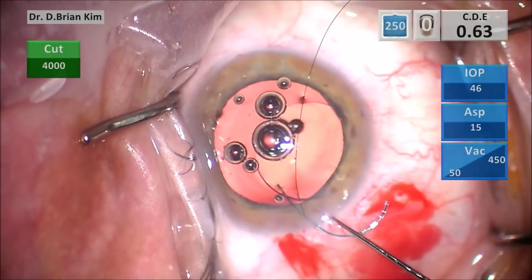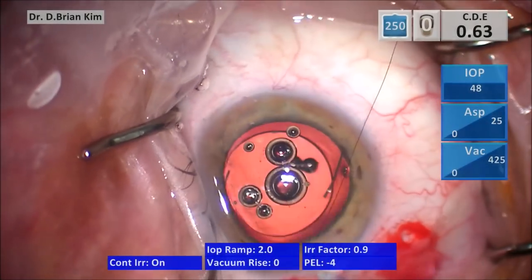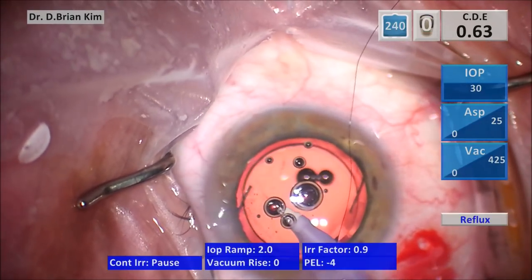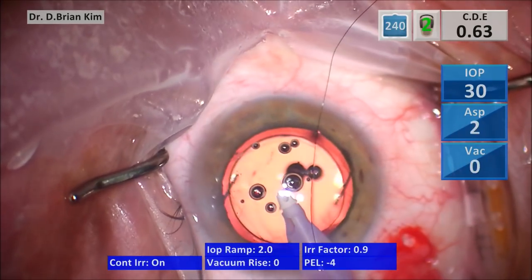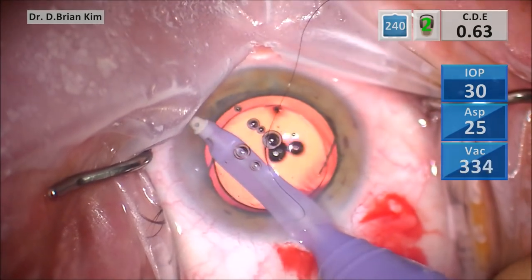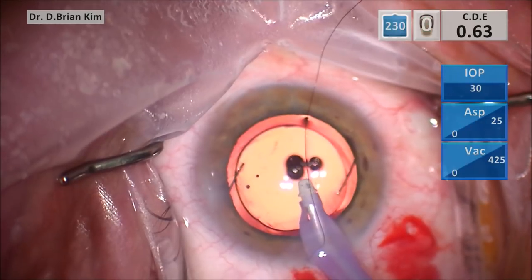And then now I'm going to just gently, with this Sinskey hook, place the trailing haptic into the ciliary sulcus. At this point, again, I'm on a low flow setting. The IOP is again at 30, and I'm going to remove the cohesive viscoelastic from the anterior chamber. You can see everything looks quite good. I don't see any vitreous in the anterior chamber at this point. The lens is well centered.